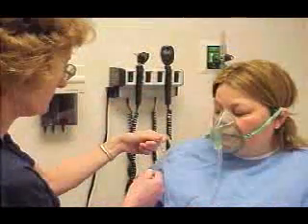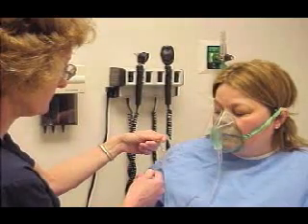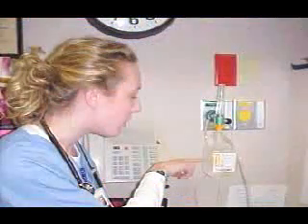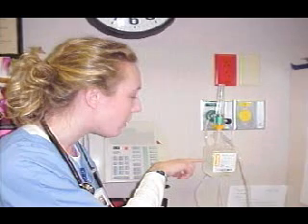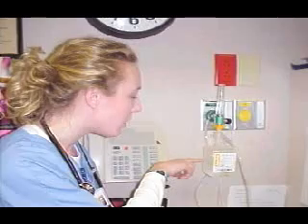Use lubrication to the lips and mouth as well as to the nose with a non-petroleum based lubricant. Keep the oxygen tubing free of kinks so that the flow of oxygen is not obstructed. Observe the flow rate to ensure that it is operating properly. If a humidifier canister is being used, be sure that the correct level of distilled water is maintained in the jar and that the water is bubbling as the oxygen passes through it. Report any problems to the nurse immediately.